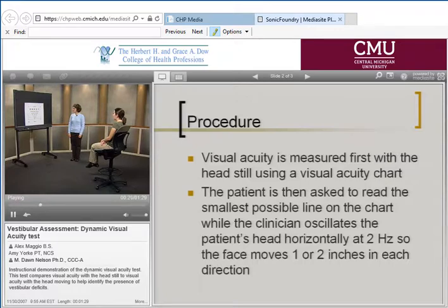O, K, S, V, Z. After that line is read, the examiner will stand in front of the eye chart to prevent the patient from memorizing subsequent lines. The patient will be instructed to close their eyes.